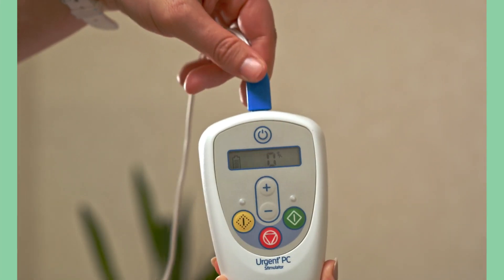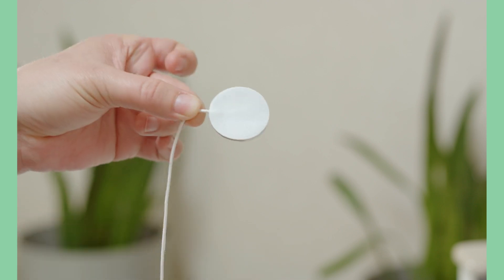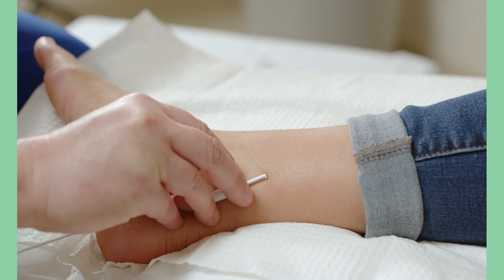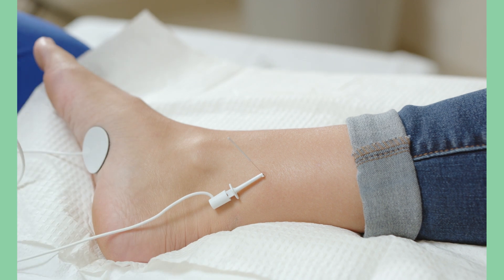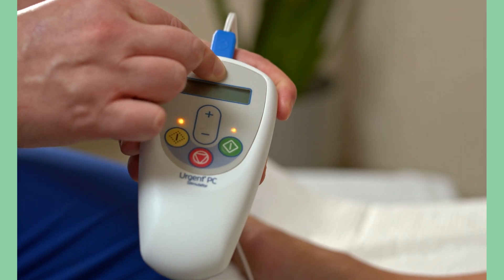Connect the lead wire to the stimulator. Remove the adhesive backing from the surface electrode and place the surface electrode on the inside arch of the foot on the treatment leg. Attach the needle electrode clip by depressing the plunger and hooking it around the needle electrode. Turn on the stimulator.